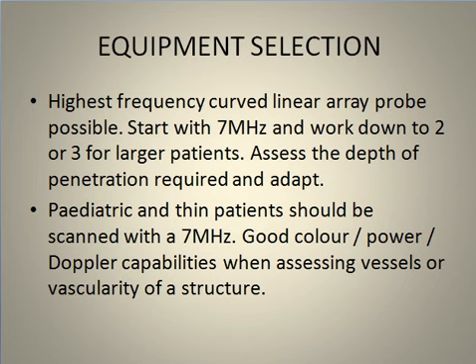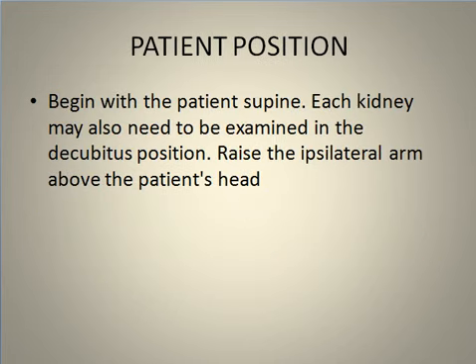We should start with the probe, depending on the patient size. If the patient is pediatric or thin, we can start with 7 megahertz. If the patient is obese, we can start with 3 to 5 megahertz, depending on the size and build of the patient.